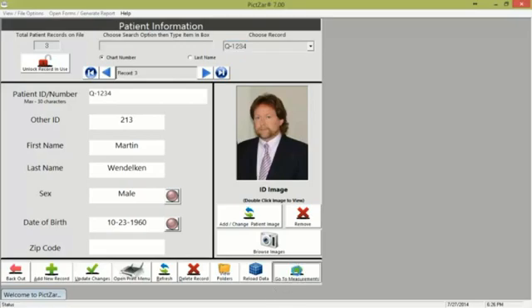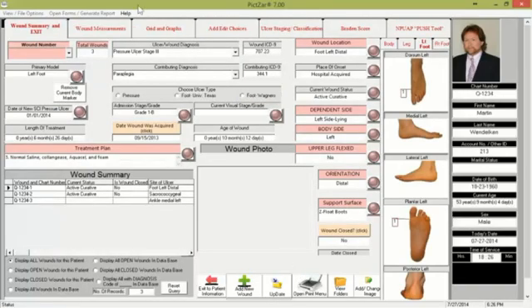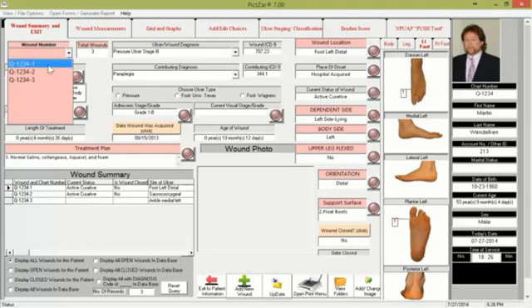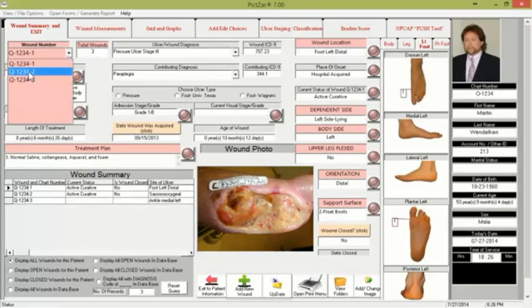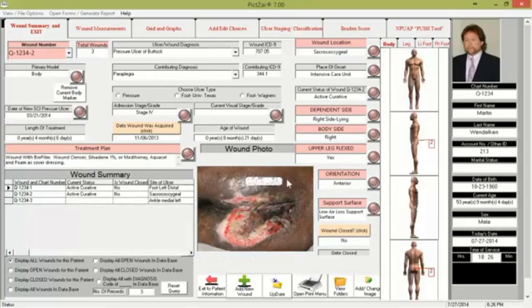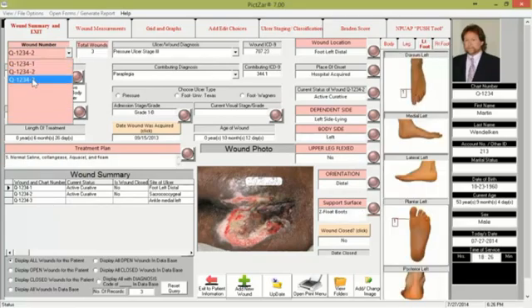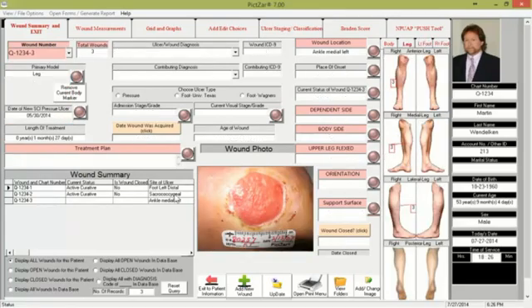After choosing the patient, you click the 'go to measurements' button on the lower right. This opens a form that has a number of tabs at the top of the screen. The first tab is the wound summary, or the wound profile. Patients can have more than one wound — in this case the patient has three wounds: a foot ulcer, a pressure ulcer, and a leg ulcer. The wounds are automatically named using the patient ID and wound number, such as Q12341-2 or -3.